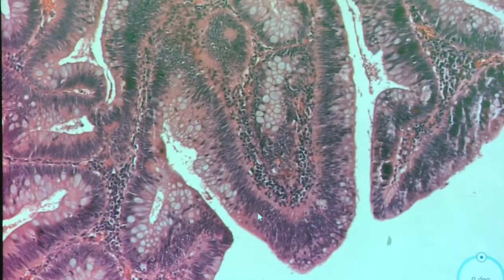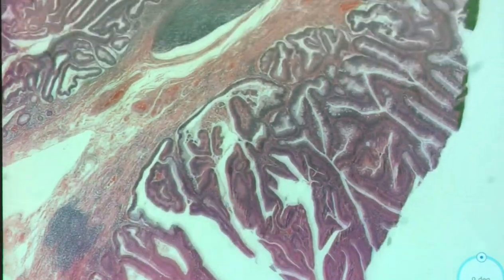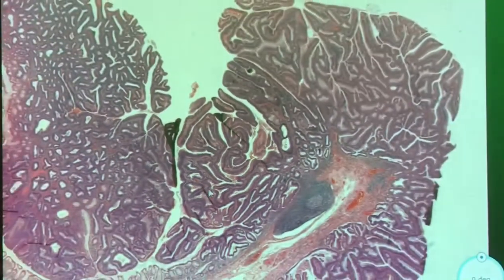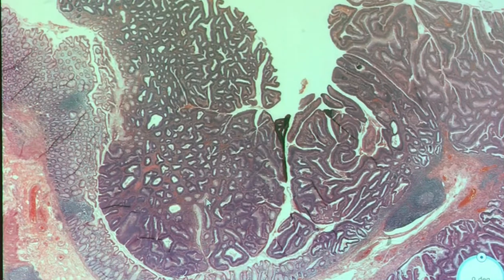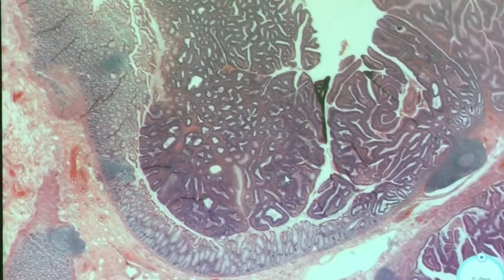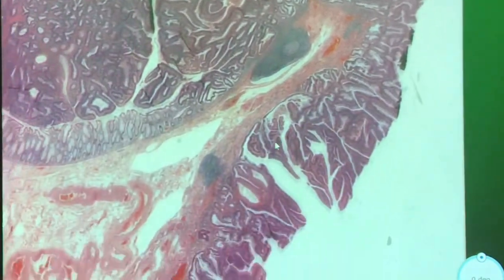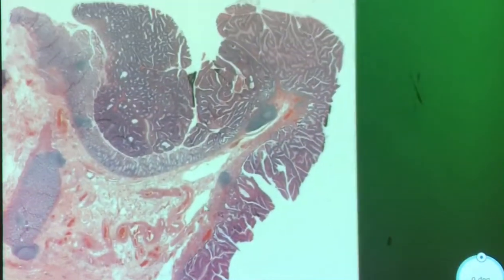See some mild dysplasia here, kind of like in a TA, but this is more like a villous architecture. Well, maybe tubulovillous adenoma. It's not quite there yet for a villous adenoma. I haven't seen many of those, but I feel like this is not enough. Yeah, it has to be very finger-like. Whereas this, it almost looks like it's arborizing, like a maze where you could almost trace all the areas.